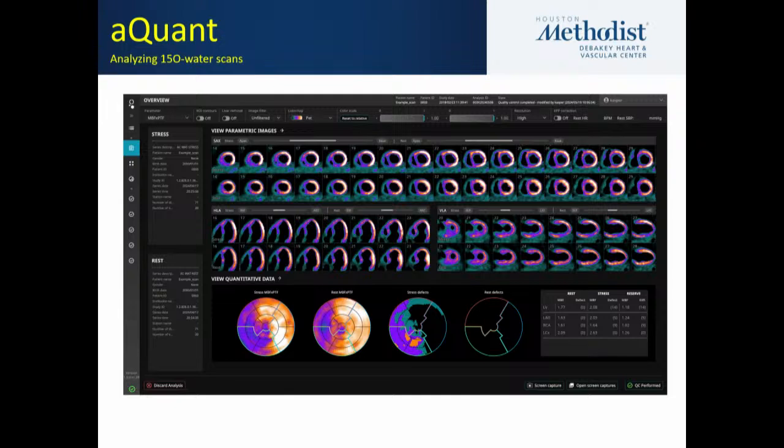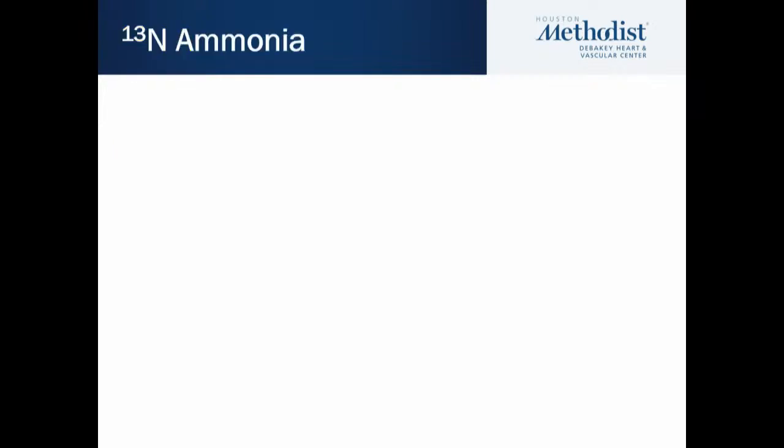But for flow, you calculate flow, and that's the ideal radio tracer for you. But if you're looking for TID or a perfusion defect and others, O15 water is not going to give you the best images, although there are now some attempts to give you some sort of images that you can see where a perfusion defect is.